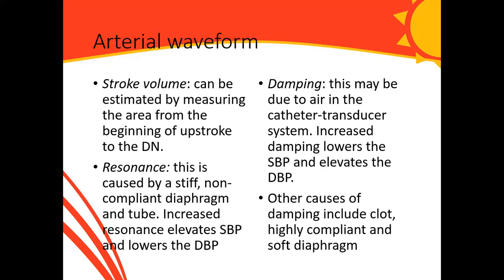Apart from the presence of air in the catheter transducer system, other causes of damping include clot formation, and when the system is highly compliant, maybe the diaphragm is too soft, which is the interface between the transducer and the Teflon catheter.